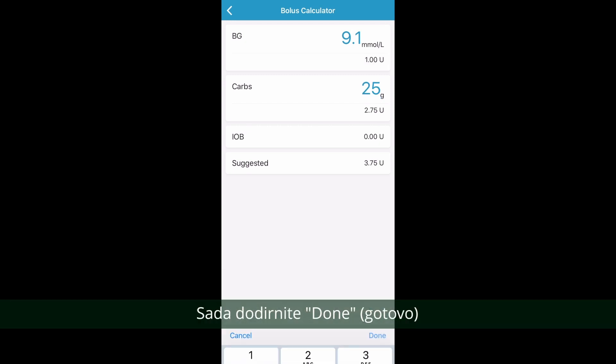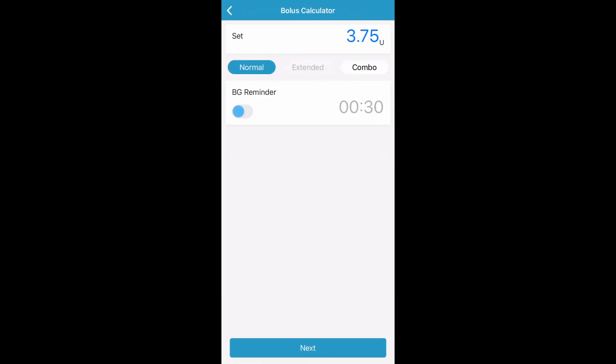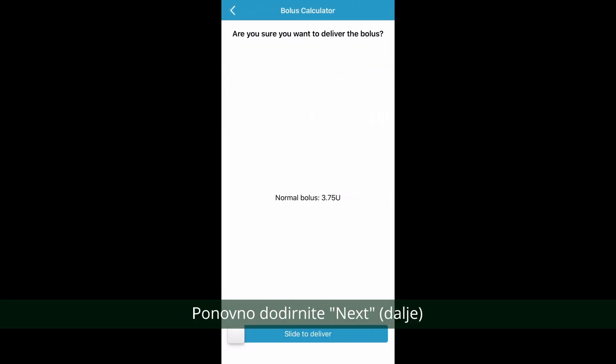Now tap done. Now tap next. Now tap next again. Now slide to deliver the bolus.